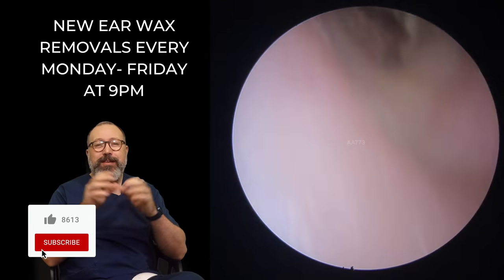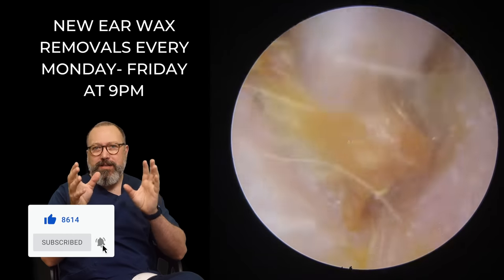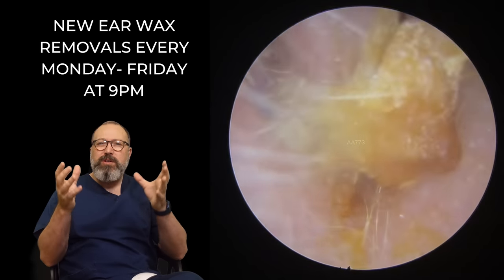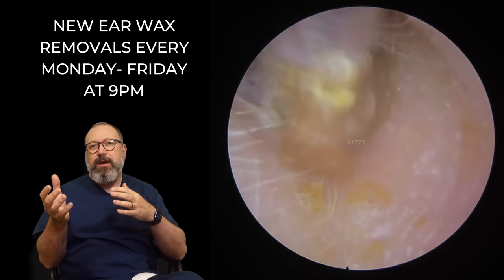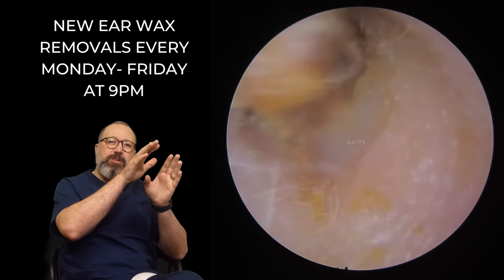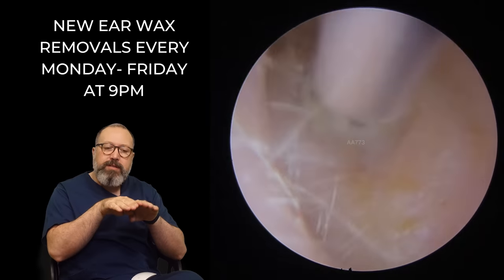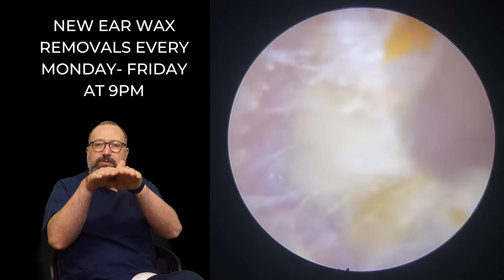Two patients in this compilation video. You can see this first patient here — what appears at first glance to be a little bit of wax, but what we're actually seeing is skin that's come away from the canal wall. Now remember we talked about this migration process of skin — that epithelial layer getting towards the outer part of the ear canal and then hardening up, breaking away and coming away with the wax. When it transitions from that inner two-thirds, which is the bony portion of the ear canal — the more medial portion — that bony portion butts up against the cartilaginous portion, the outer, more flexible portion of the ear canal. Where those two meet is called the isthmus.